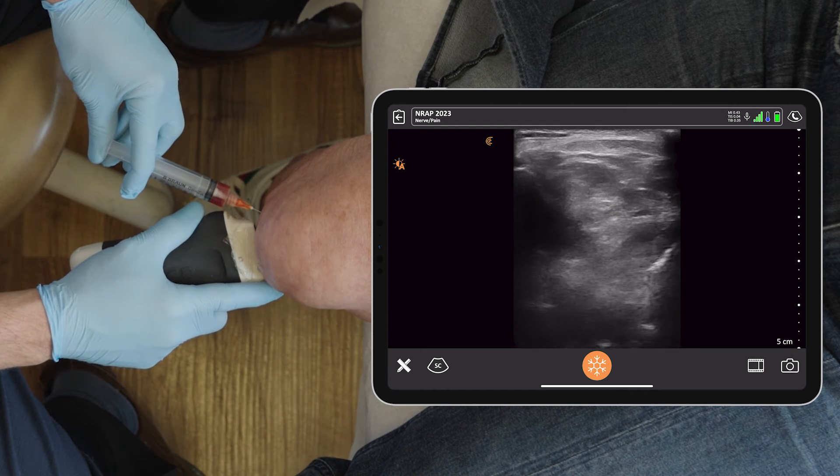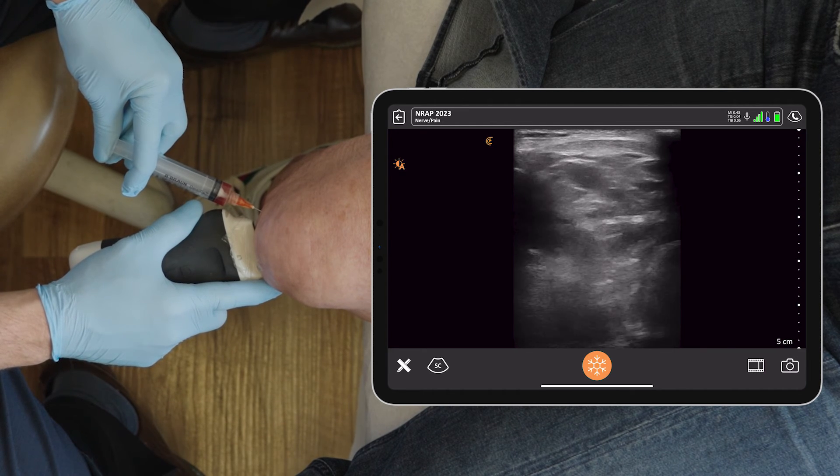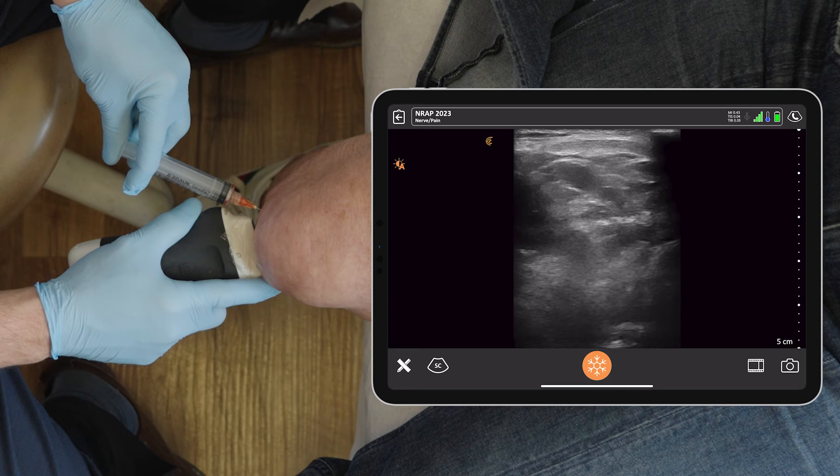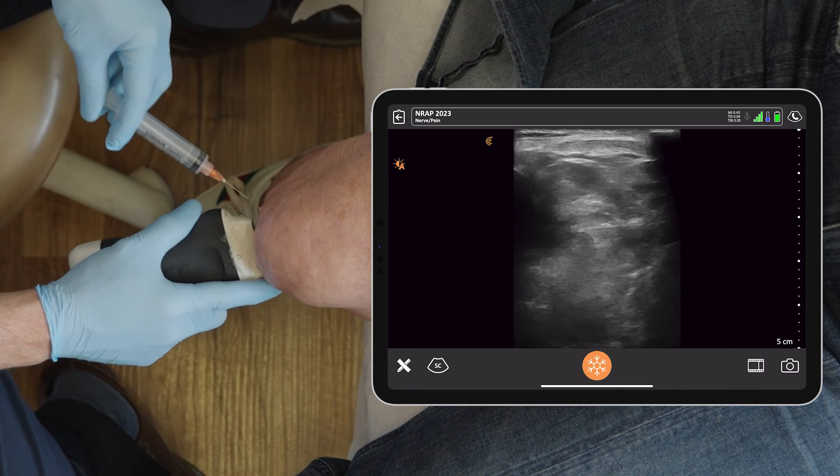Am I hurting you? Good. With the ultrasound, we can avoid encountering bone upon insertion, so it usually hurts less. Now it might hurt a little bit because we're distending the joint, and the needle's coming out — and we are all done.